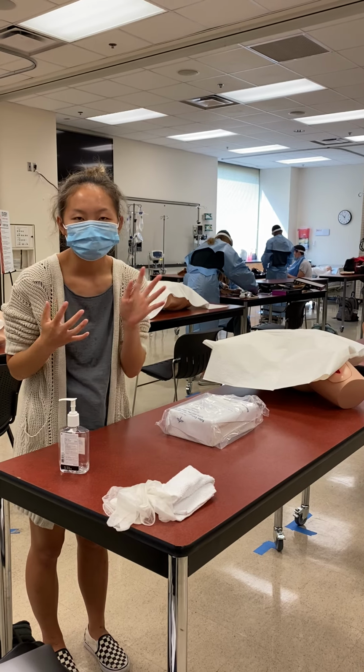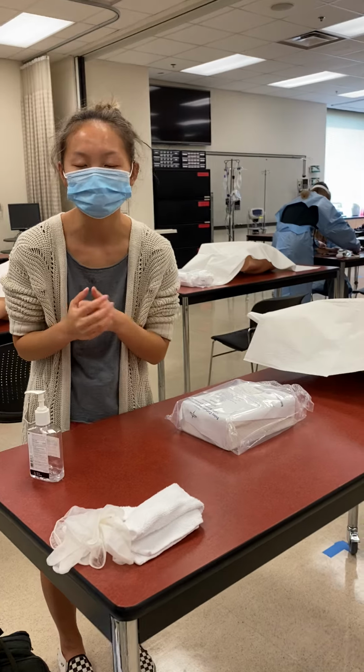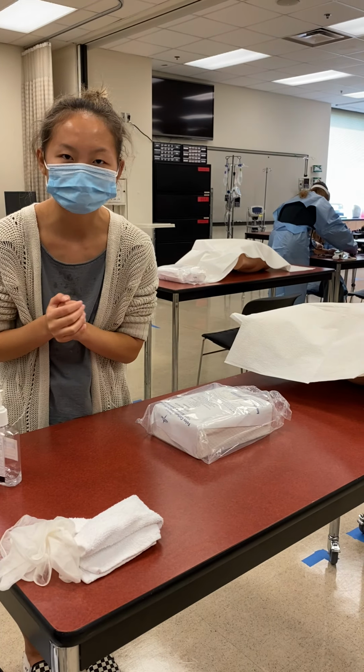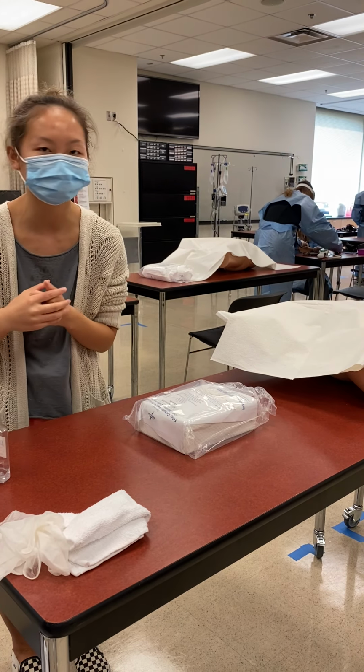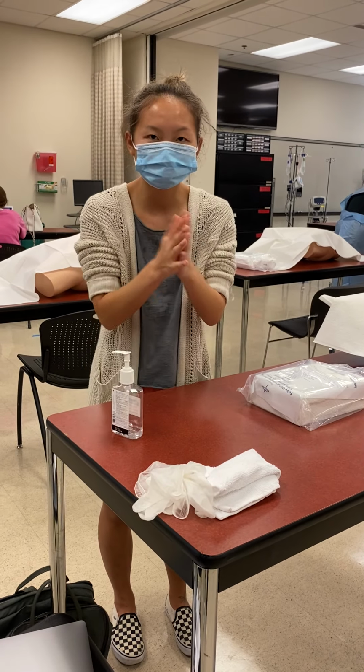Hi, my name is Sophia. I'm going to be the student nurse today working with this patient. I'm going to be performing the Foley catheterization skill, but before I go into the patient's room, I need to do hand hygiene. So I want to get some hand sanitizer.